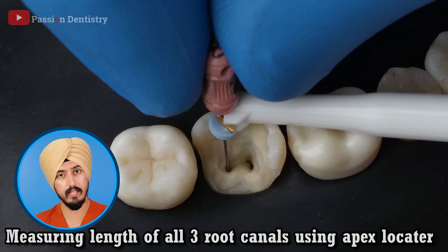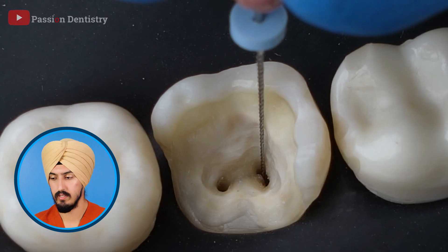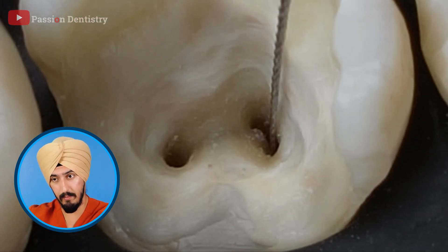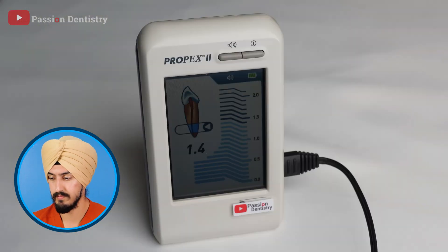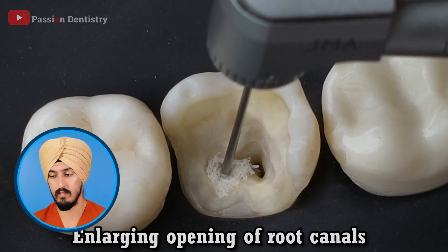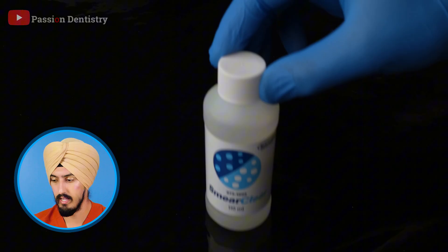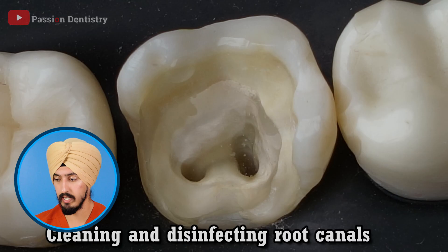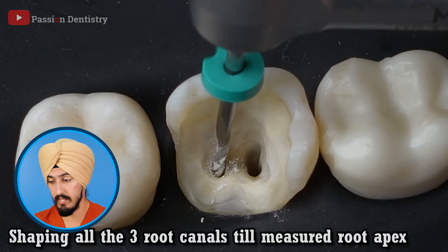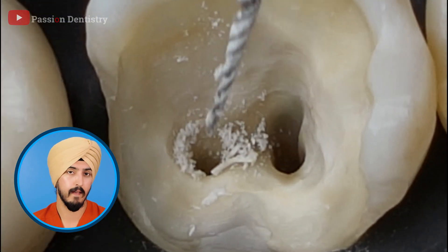That's actually how you measure it — you take a file, go in there, and the apex locator tells you if you're at the tip, too far, or too short. Then you take that measurement, write it down, and use it for every single canal. You have to make sure you measure from the same spot every time, because if you change that spot the whole thing can be off. Now he's doing it for each canal, and typically we'd use some sort of irrigant — you don't want that canal super dry like he's doing because the files have a higher chance of breaking. That's what he's doing right now: cleaning and disinfecting with an irrigant. Typically we use bleach as the main one, though you can use other things along with it.